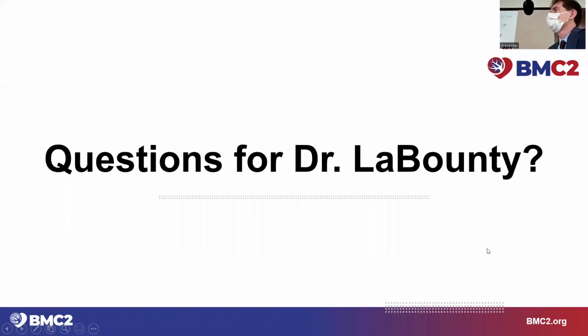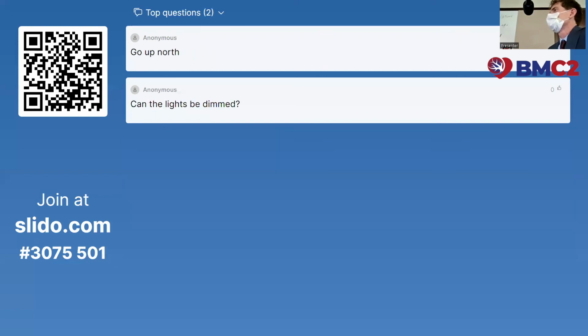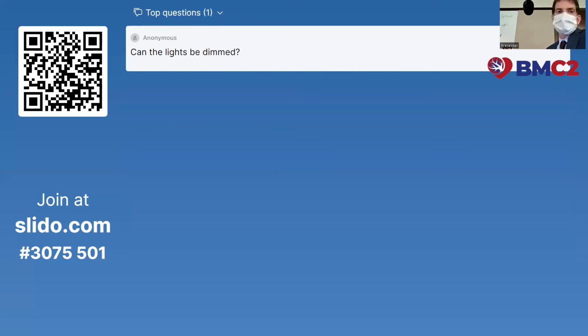That was an awesome talk on a really complicated subject. It's more of a comment, but one of the things I've been thinking about is how much I love patients who come to the cath lab after they've had a coronary CT, because we often get referred patients who had a bypass 10 years ago in Iowa or something like that, and we don't know where the grafts are or how many grafts there are, and we have an entire roadmap of where we're going. And I bet, if we studied it, and maybe it has been studied, that their procedures are actually safer, shorter, and have less radiation.